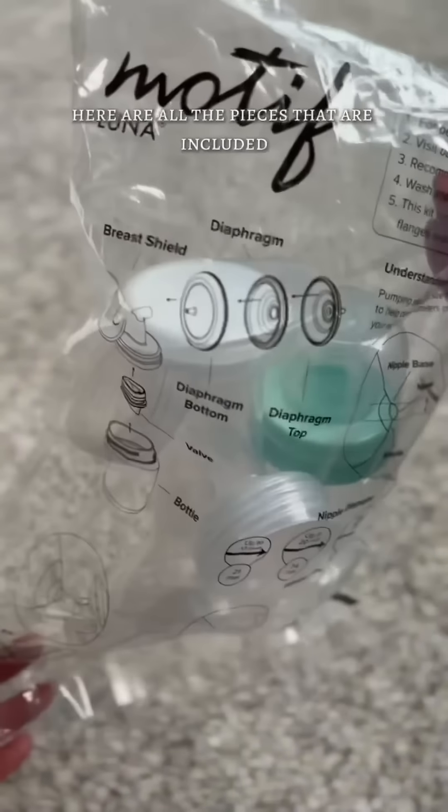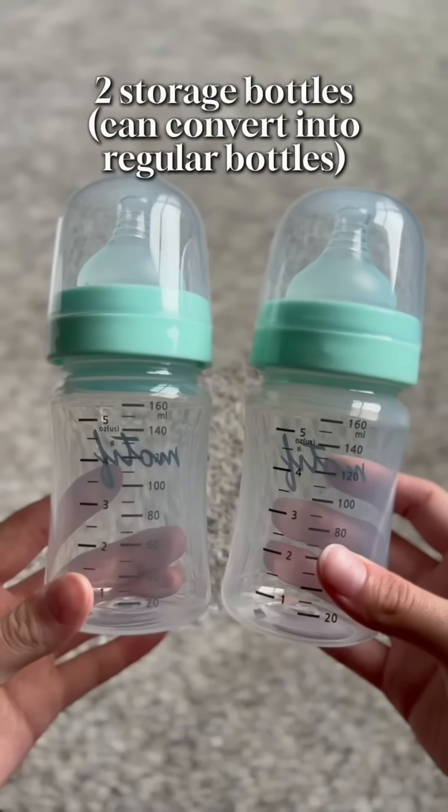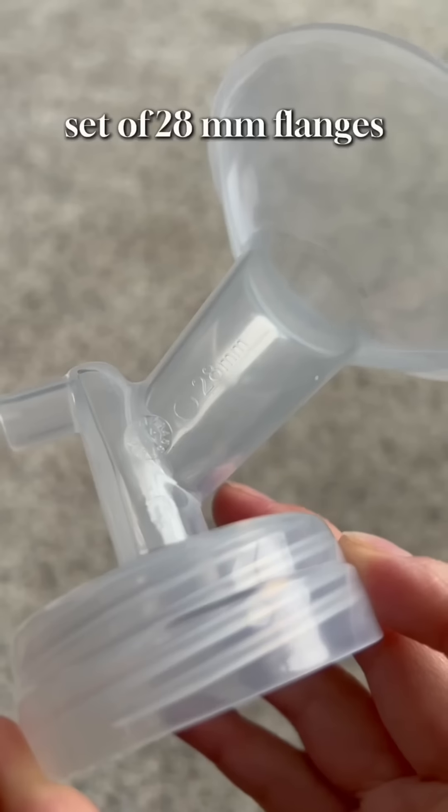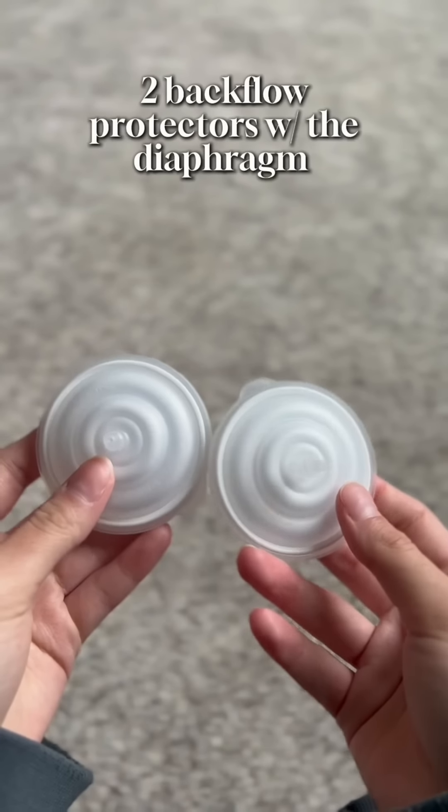Here are all the pieces that are included: a set of tubing, storage bottles you can convert into drinking bottles, two sets of flanges in 24 and 28mm, duck valves already attached, and two backflow protectors.